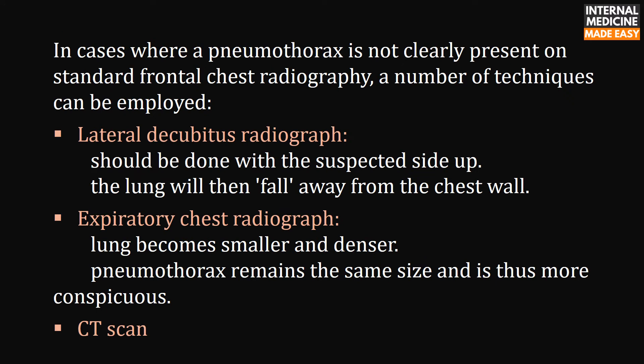In cases where a pneumothorax is not clearly present on standard frontal chest radiography, a number of techniques can be employed: a lateral decubitus radiograph should be done with the suspected side up so the lung falls away from the chest wall; an expiratory chest radiograph, where the lung becomes smaller and denser while the pneumothorax remains the same size and is thus more conspicuous; and CT scan.